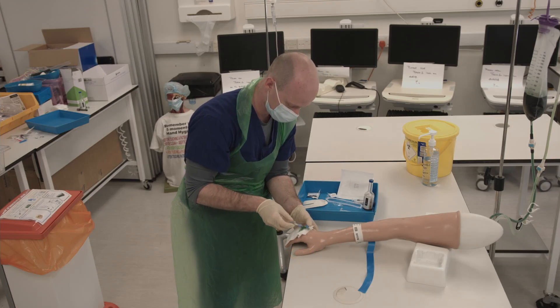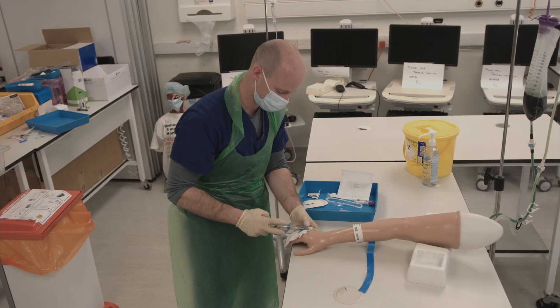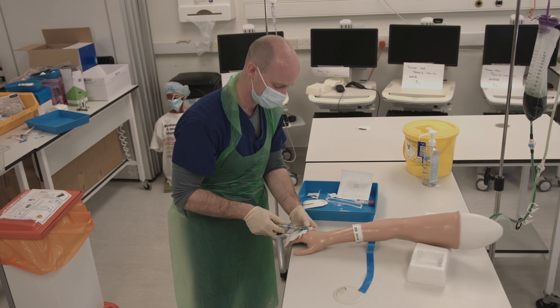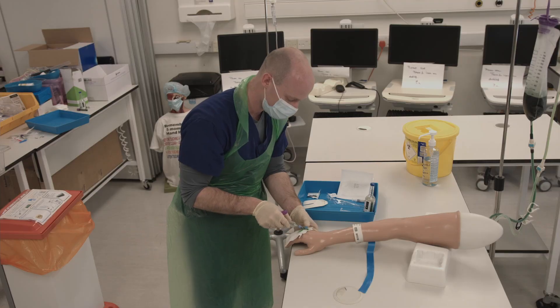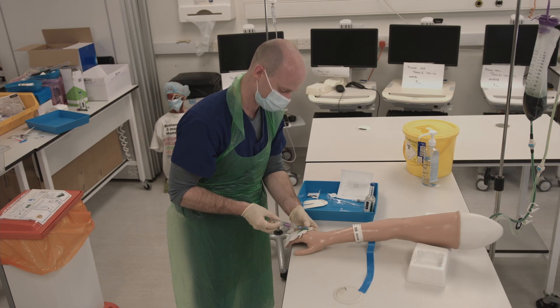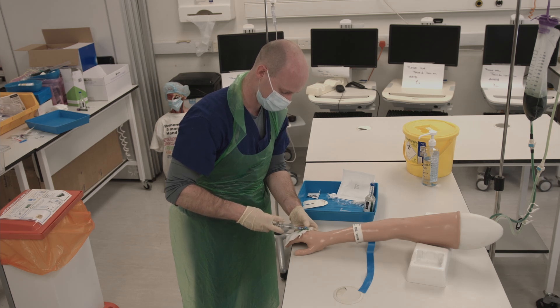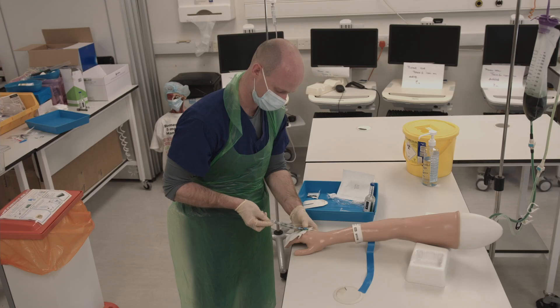You can now attach your bung and vacutainer. Take your aerobic and then anaerobic blood cultures, making sure to angle the bottle downwards so the solution in the bottle doesn't enter the cannula. Invert the bottles and draw blood into the purple blood tube. Finally, draw blood into the VBG syringe and expel any air.